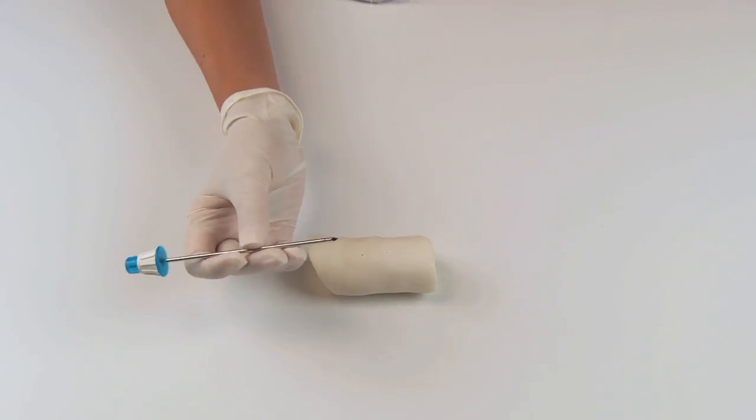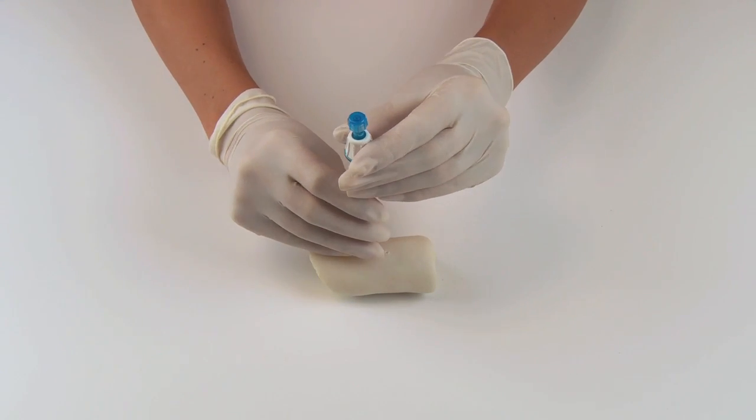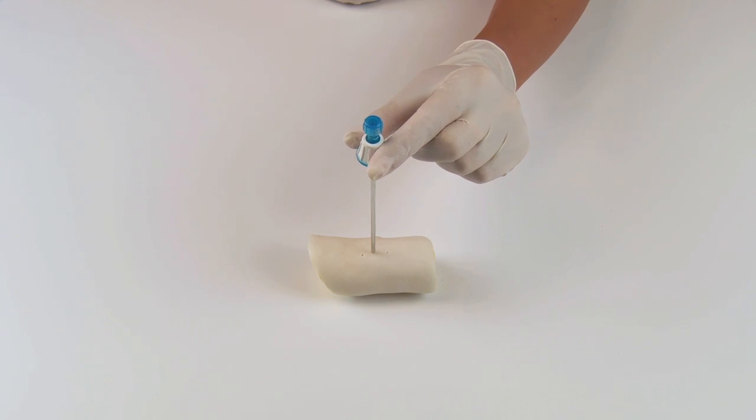Press the penetration cannula with the stylet firmly down until the tip reaches the bone. Remove the stylet while holding the penetration cannula firmly against the bone to maintain the position.